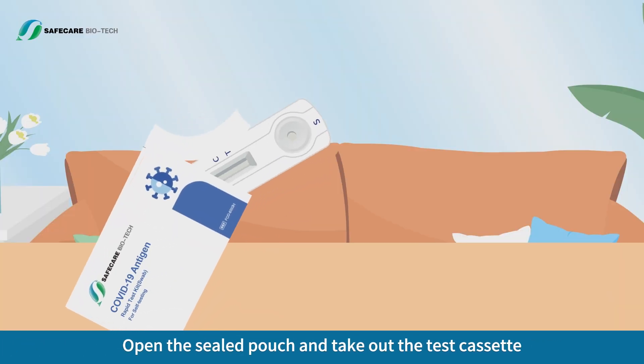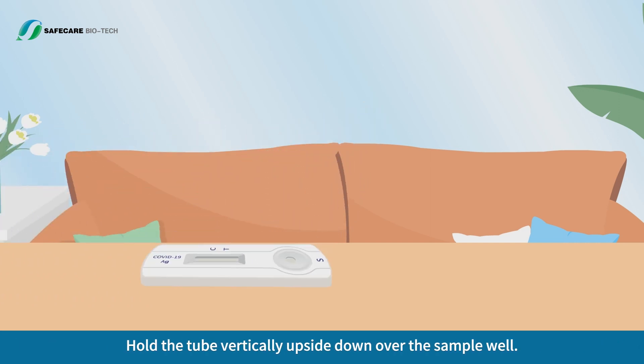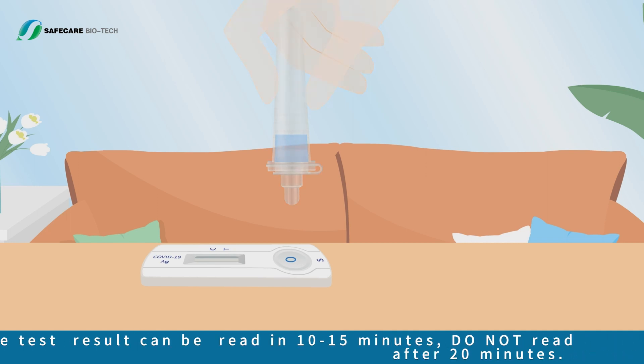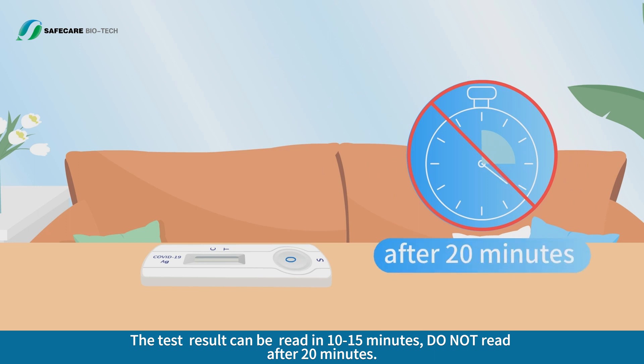Test Procedure: open the sealed pouch and take out the test cassette. Hold the tube vertically upside down over the sample well. Add three drops of specimen into the sample well by gently squeezing the sides of the tube, then start the timer. The test result can be read in 10 to 15 minutes. Do not read after 20 minutes.